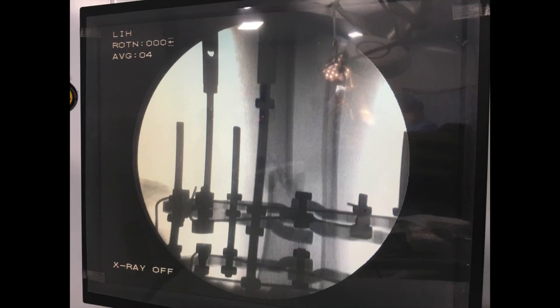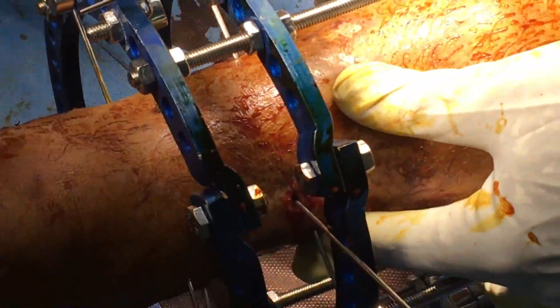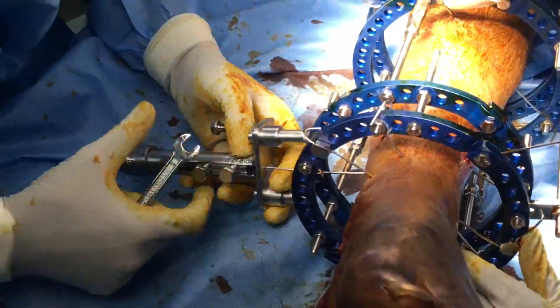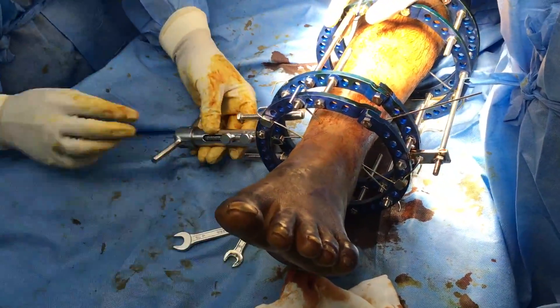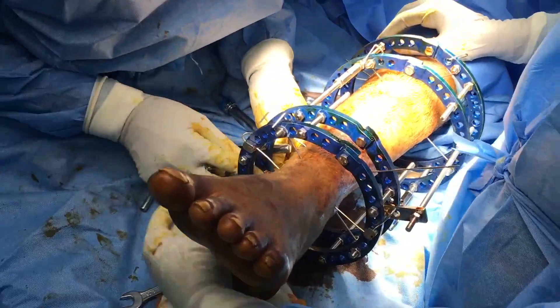A C-arm image is now taken and it is seen that there is a lateral shift of the distal fragment. This is corrected with an olive wire. An olive wire is passed from the side of the shift — lateral to medial — and using a manual tensioner, anchoring the wire, the olive is pulled towards the medial side, ensuring that the fragment falls into place and reduction is hairline.